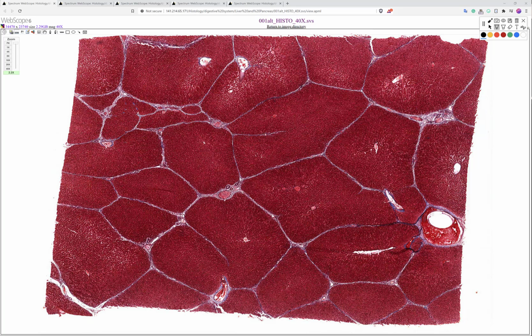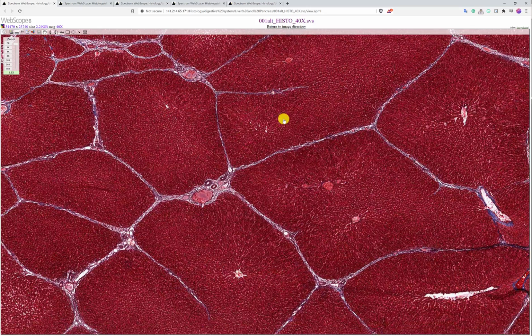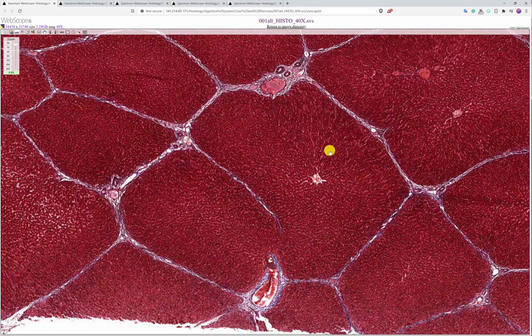In this video, I will walk you through the histology slides for the digestive lab, and we are starting with the liver. For the liver, we can think of it as several units coming together. Each unit is called a lobule. So each one of these structures is a lobule. Now, for this lab, what you need to do is look at the image and understand where the lobules are. Then you will zoom in to one of them.